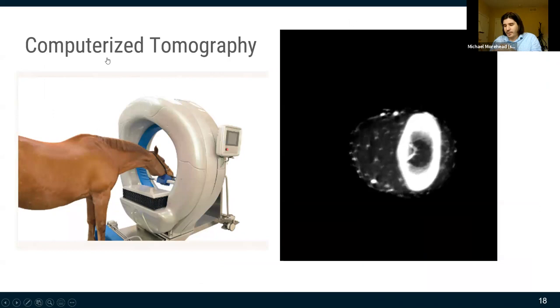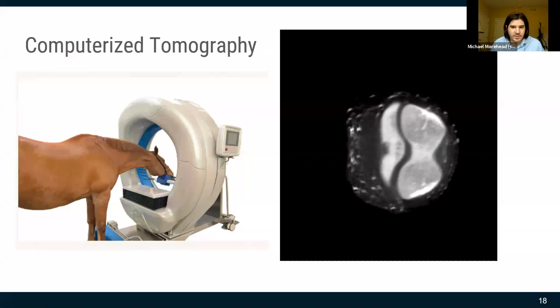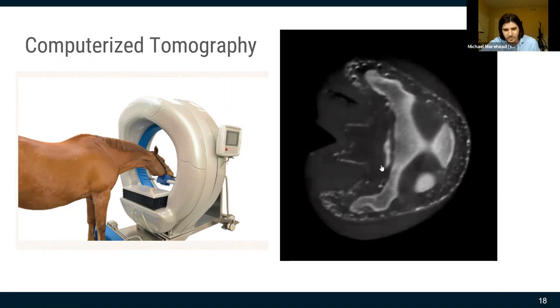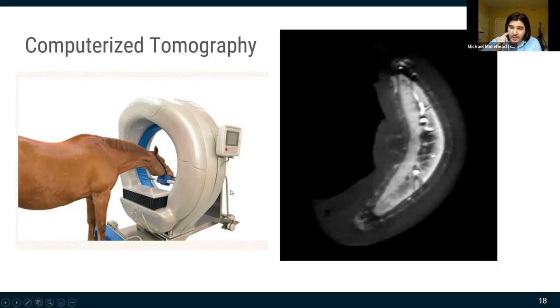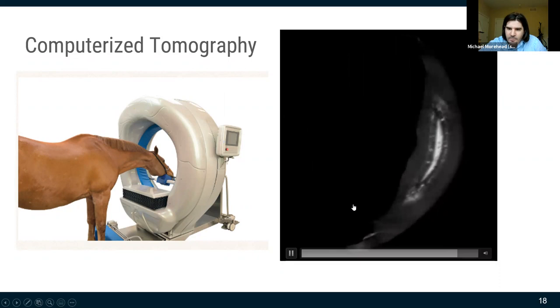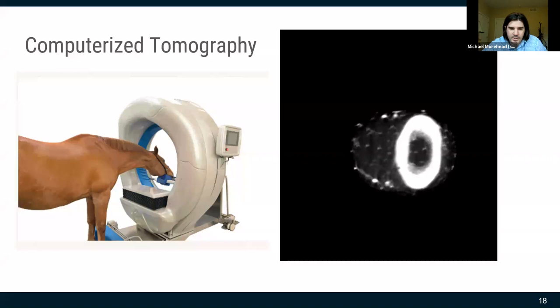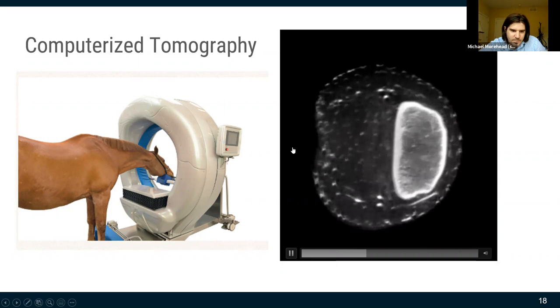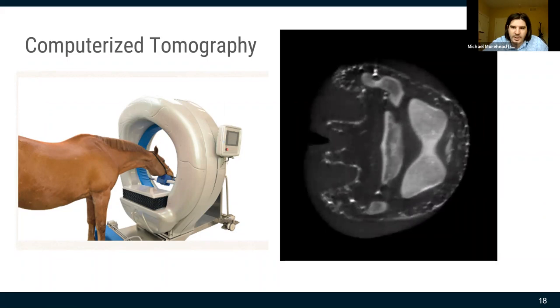There are still companies pushing conventional CT limits. We work with Epica International, which makes specialized CT for horses and dogs using a hybrid cone-beam serial imaging platform with good isotropic resolution. Here's a CT dataset of a horse's hoof — as it moves through slice by slice it's blurry and the little blips that appear and disappear are hard to understand. Viewing things this way is how we've always done it, but it doesn't have to be.